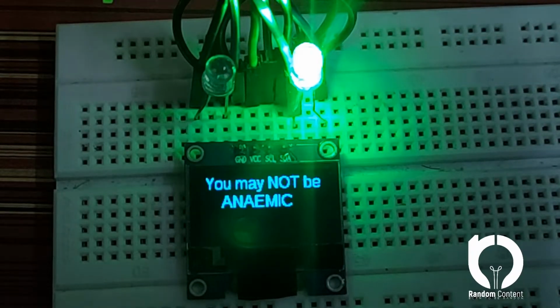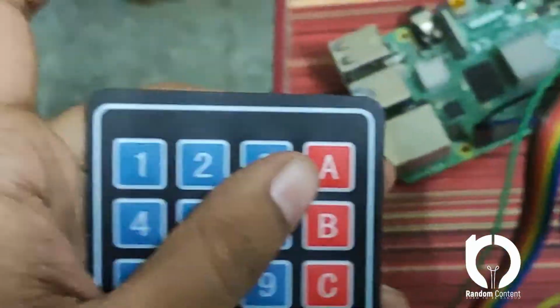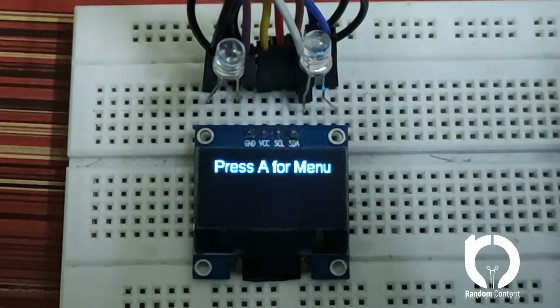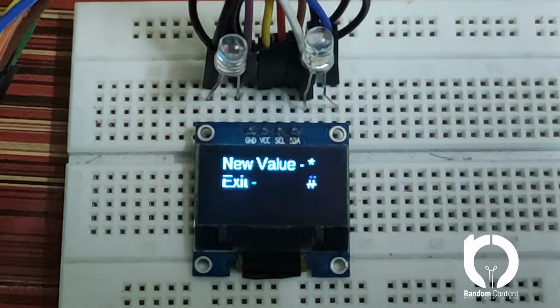So it is now showing you may not be anemic, and the green light will turn on for about 10 seconds, and then it will get turned off and ask to press any button to continue. If I press any button, it will ask for A for menu. The A is the A on the keypad. If I press A, it will ask for new value as star and exit as hash.